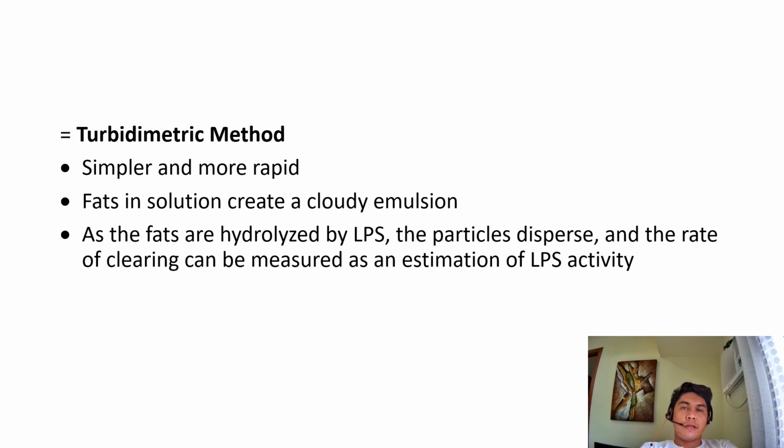Next method, you have the turbidimetric method. It's simpler and more rapid. Fats in solution create a cloudy emulsion. As the fats are hydrolyzed by LPS, the particles disperse and the rate of clearing can be measured as an estimation of LPS activity.